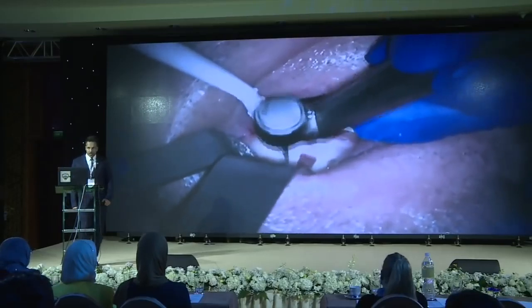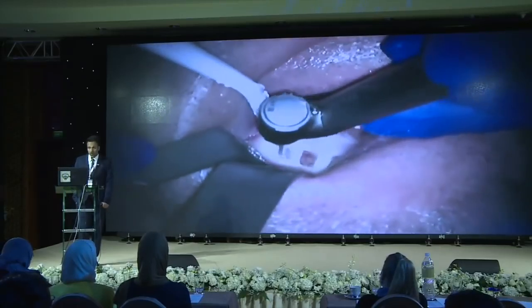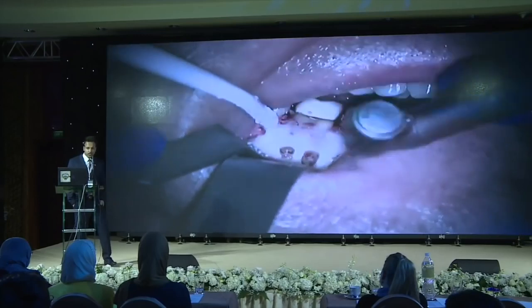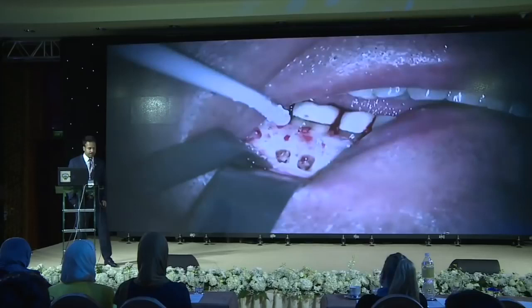So with CBCT, because it's really accurate, you can make 2 osteotomies to the molar. And leaving a bridge in between actually promotes healing and makes healing really fast compared to one big osteotomy.